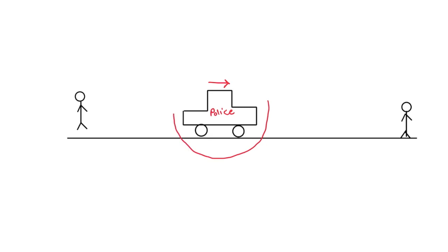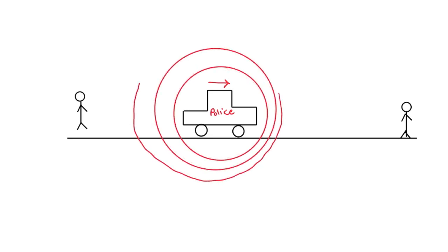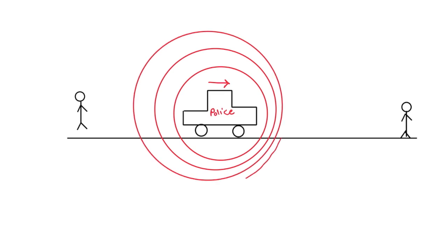To illustrate the Doppler effect as it relates to sound waves, we can visualize a car on the road that's moving first towards us and then away from us. In this scenario, the sound waves being emitted by the car's engine will become closer and more tightly packed, as if the movement of the car was squeezing them together. Our sense of hearing will interpret this phenomenon as if the pitch of the car's engine were becoming higher the closer the car gets to us.